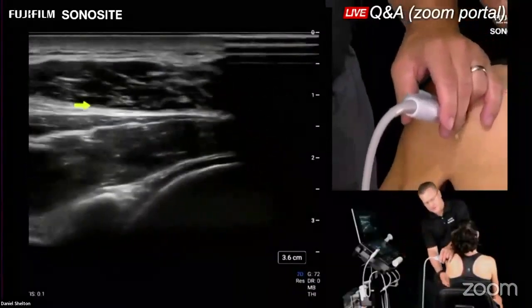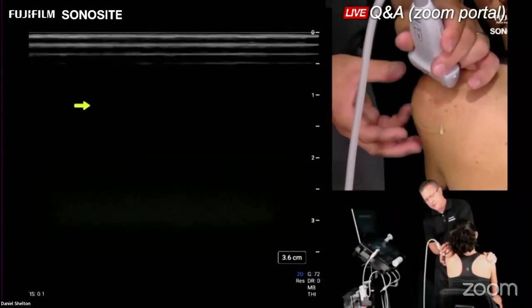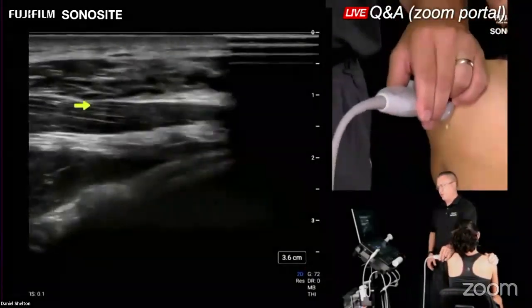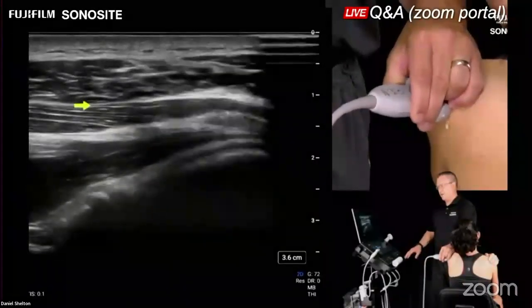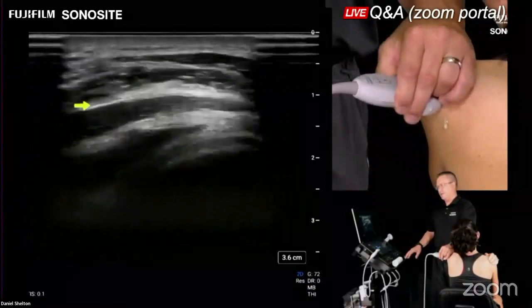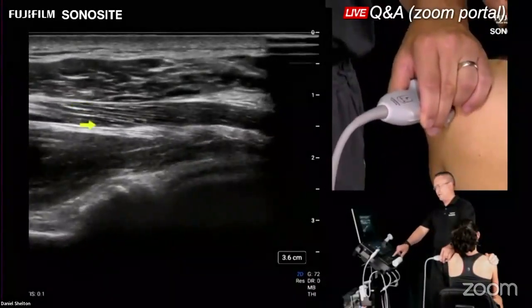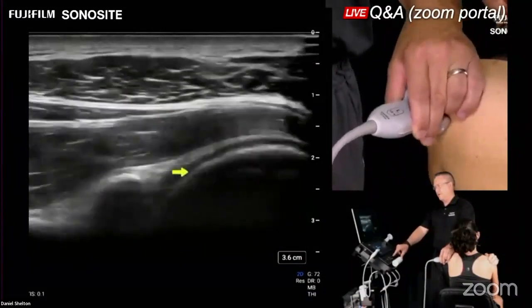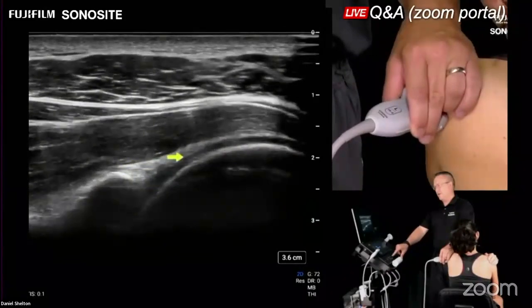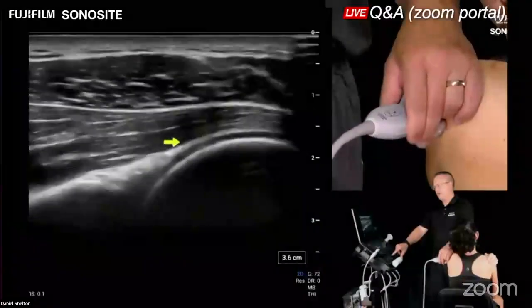Sometimes you can just have the patient grab their opposite shoulder, and that will cause the infraspinatus and the humeral head to inferiorly drop. So there I do see that central tendon really nicely, and it makes it easier to evaluate the long axis of the infraspinatus tendon. So counting our layers underneath here, we've got glenoid, humeral head, here's that posterior labrum, and then let's watch this joint capsule under the infraspinatus kind of unfold itself.